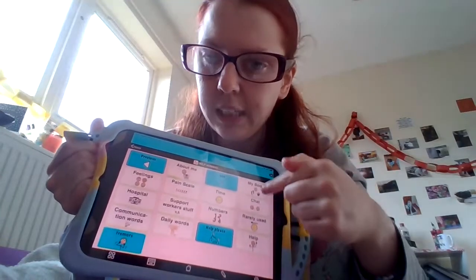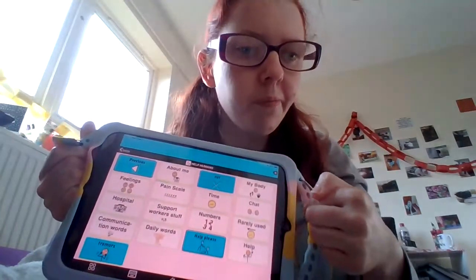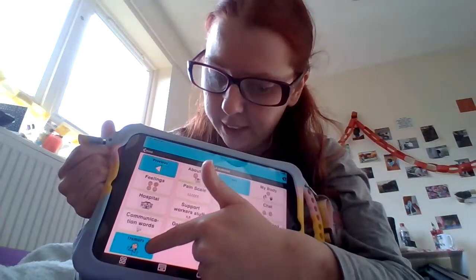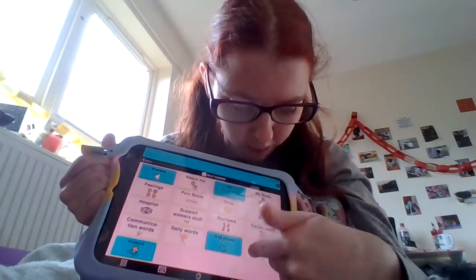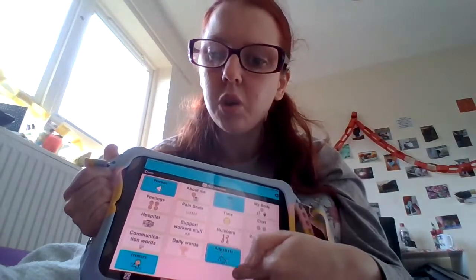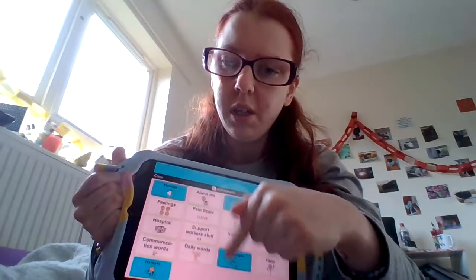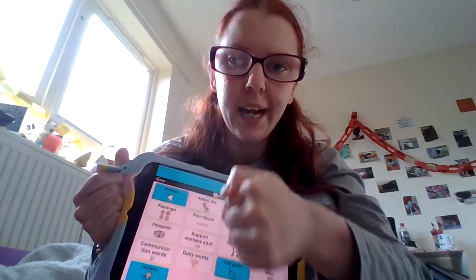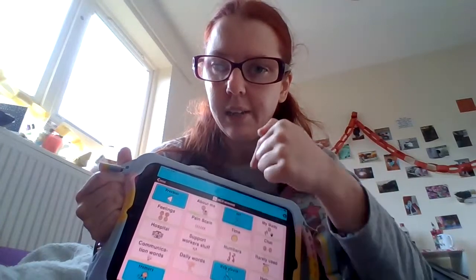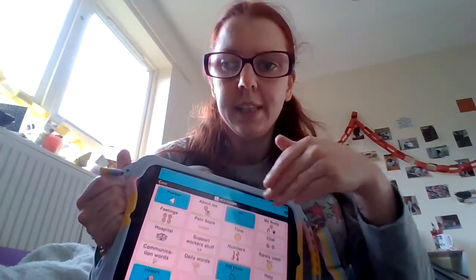And I would select either another folder, which I don't do very often, or I would select a word, which things like tremor and not and help please tend to be the ones I use a lot. Now, not, when you create a new board, it's already built in, but you can get rid of it. Because this video is quite long already, I will do a separate video on how I set this up.